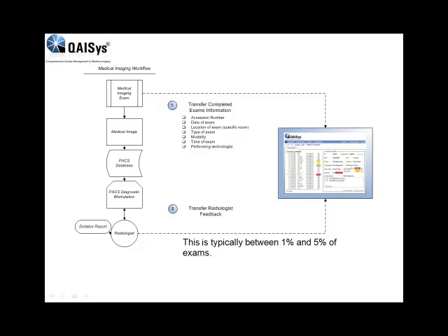There are a number of modes by which radiologists can convey feedback depending on the technology, configuration, processes, and preferences of the imaging organization. For our purposes, we only need to know from the radiologist the nature of the quality detraction and the severity of the quality detraction.